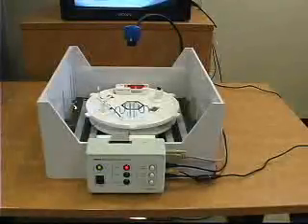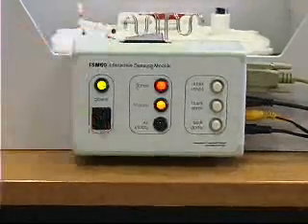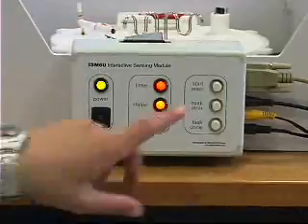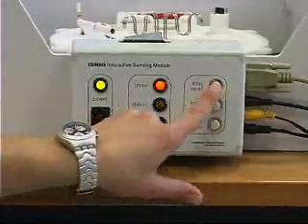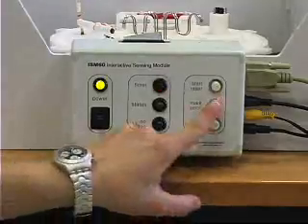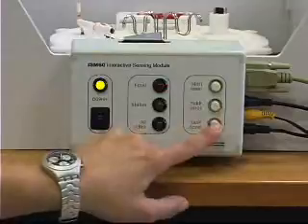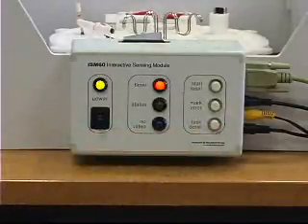The ISM60 interactive sensing module is connected to the PC or laptop computer, which is equipped with the latest LTS2000 software. The module, also referred to as the brain of the system, allows the user to control start or stop times, as well as to mark errors. In the test setting, the examiner can also control all of these items from the computer.